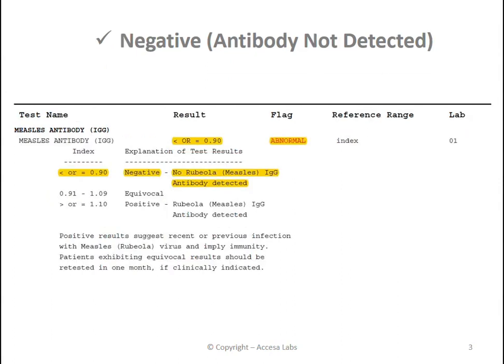Now let's take a look at a negative result. Once again, we will look for the numerical result under the result heading here. This report has a result of less than or equal to 0.90. You might also notice the abnormal notation under the flag header.